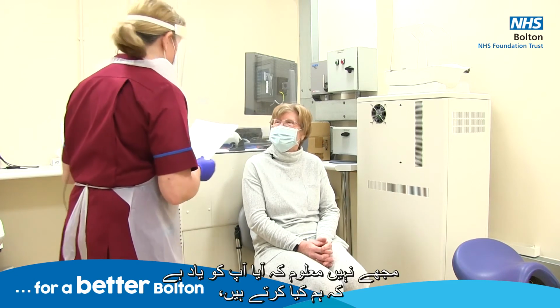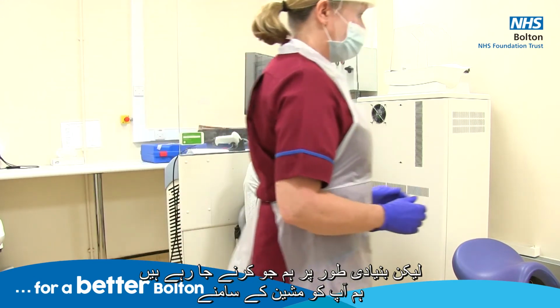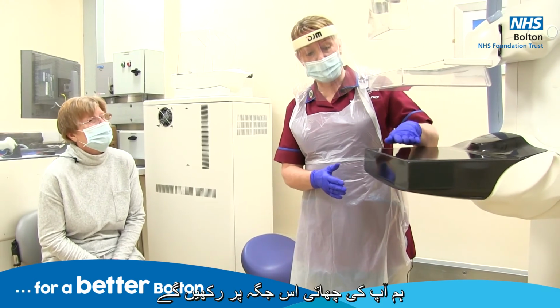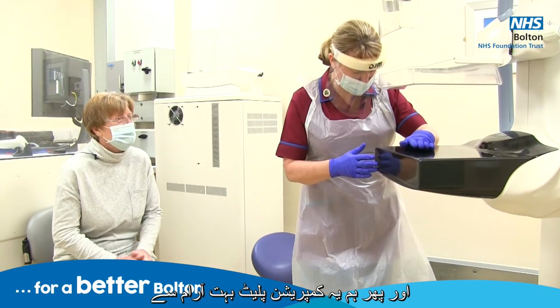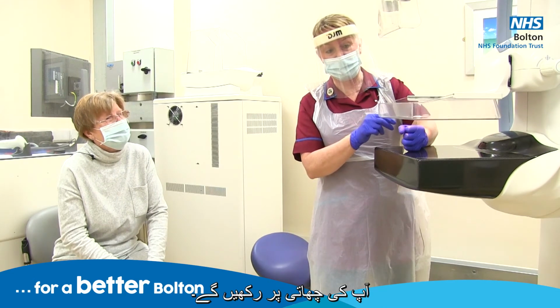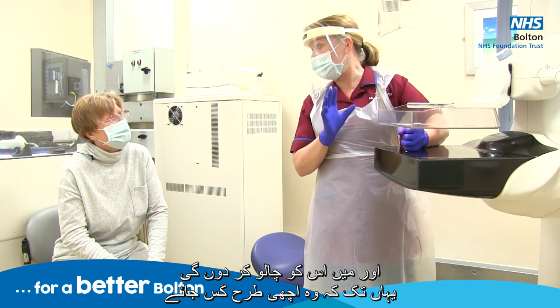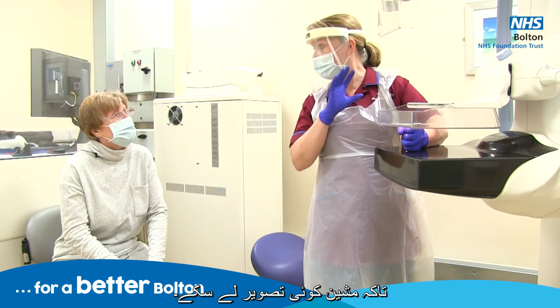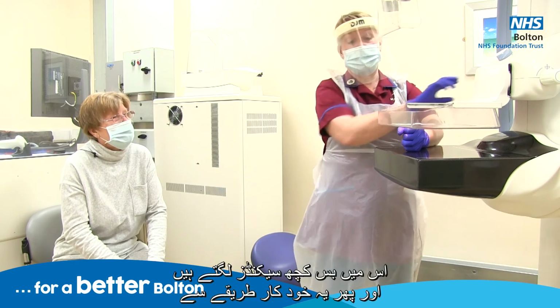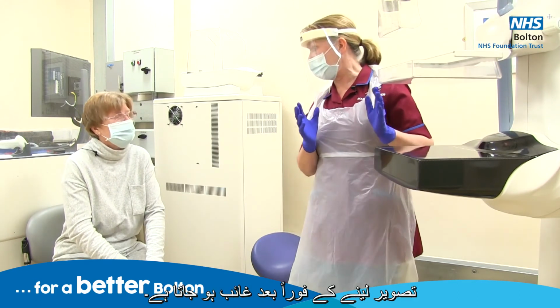Okay, that's good. Right, well, I don't know whether you can remember what we do, but basically what we're going to do is we're going to have you standing in front of the machine. We put your breast on here, and then we put this compression plate onto your breast, ever so gently. And I'll just wind it on till it's just tight enough so that the machine will take a picture. Makes a nice clear picture with no blurring. It takes just a few seconds and then it automatically pings off as soon as it's taken the picture.